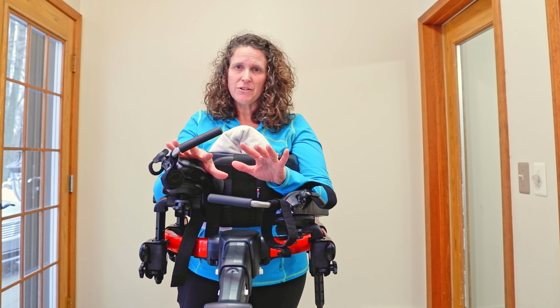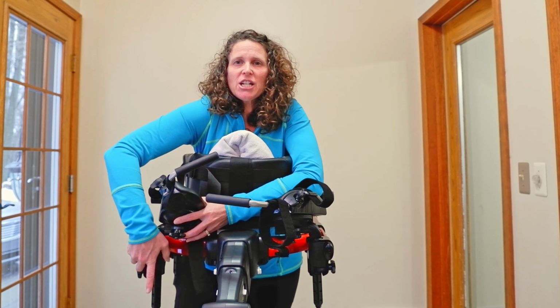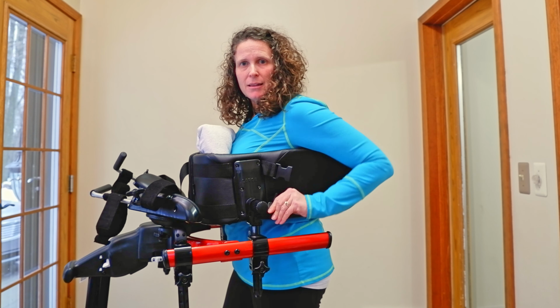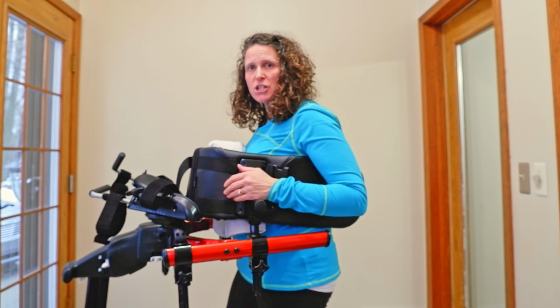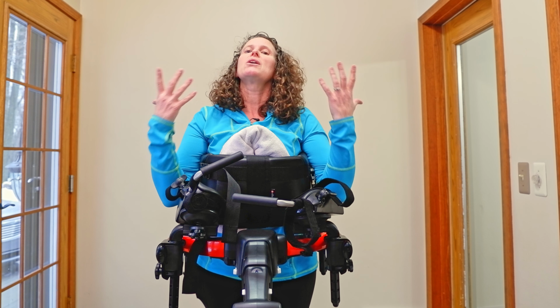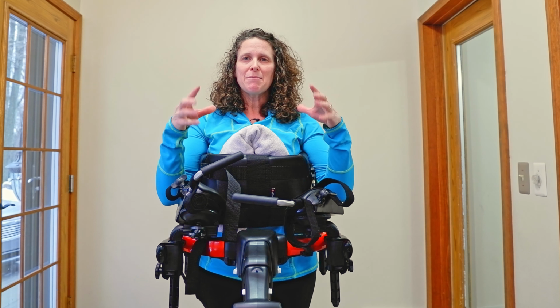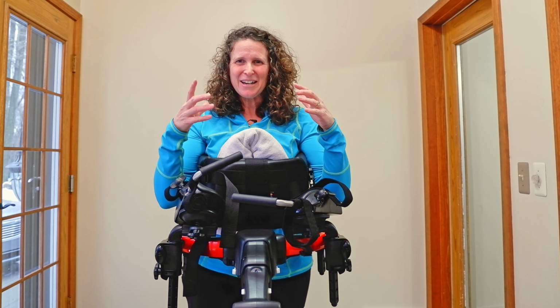Another thing that you could do after you change the arm prompts is maybe just change the angle of the chest prompt. What you would do is just loosen up the knob in the back, and that allows your chest prompt to either go forward or backwards. If the chest prompt is forward, it would encourage their head to be forward, but then you can just tilt it back a little bit, and that might just be enough with this here to help them hold their head up in this position. If you have somebody that's really low tone, you might find that if you have them tilted too far back you're gonna lose them backwards, but you might be able to find that perfect little medium where they're able to balance their head by changing the angle of their chest prompt.